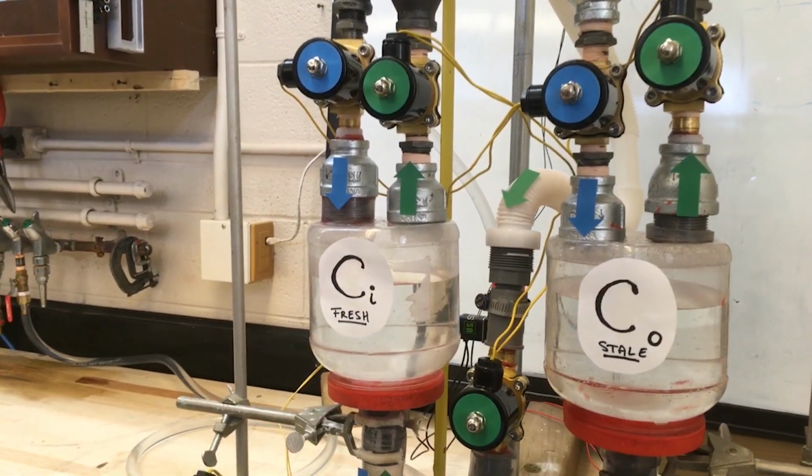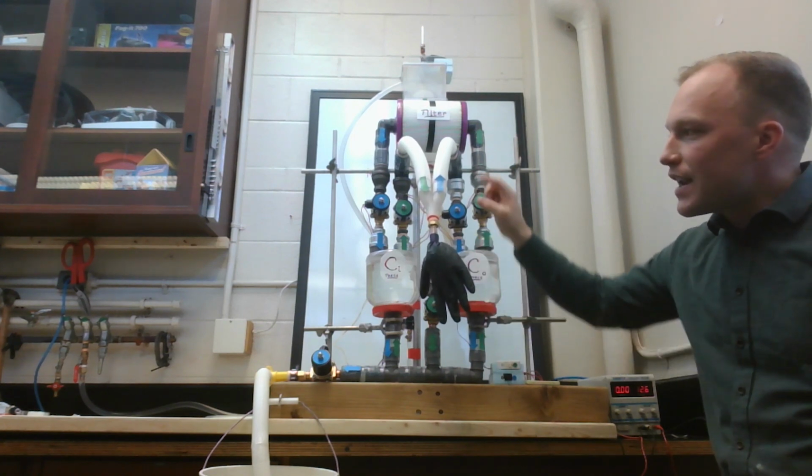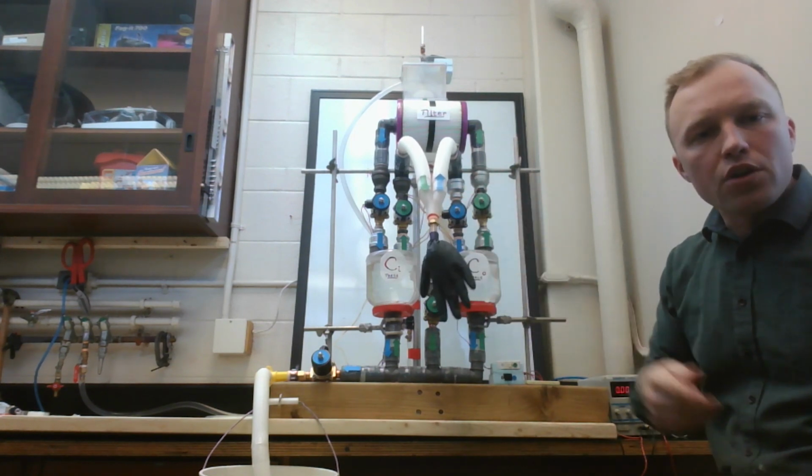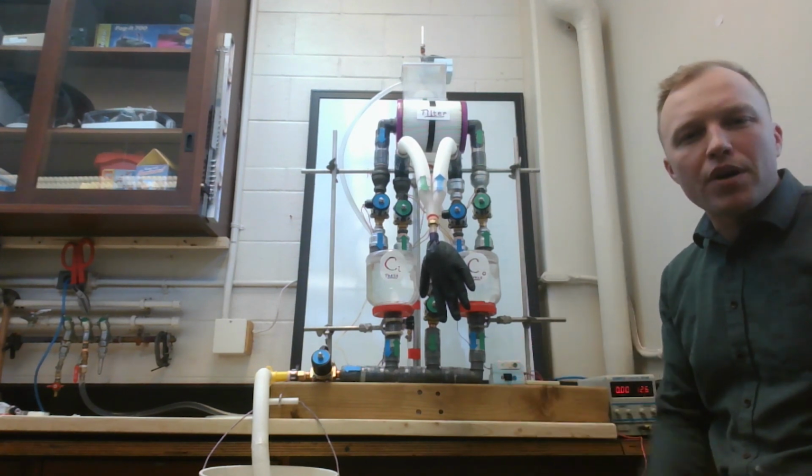Our cylinders, additionally, could be fitted with encoders to measure the volume changes. And at the Y here, we should also be measuring the flow rate to know how much air is actually coming into the body and going out from the body.